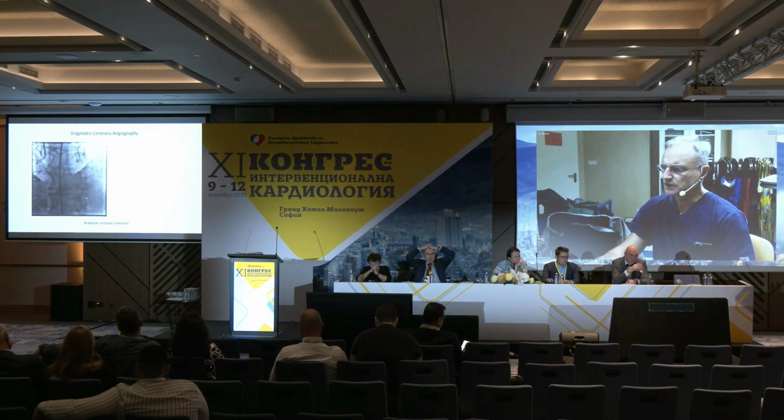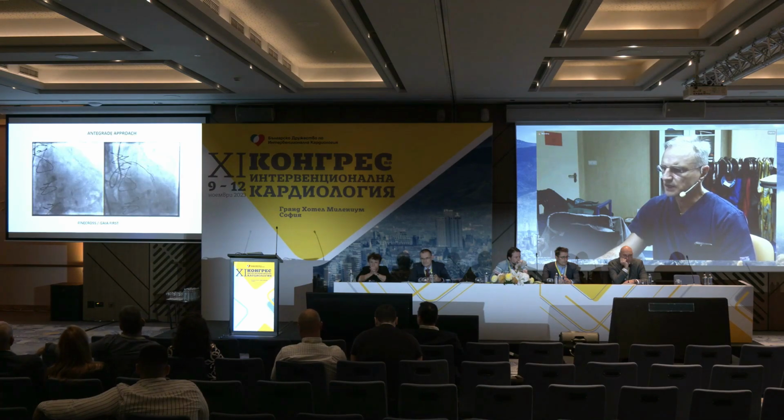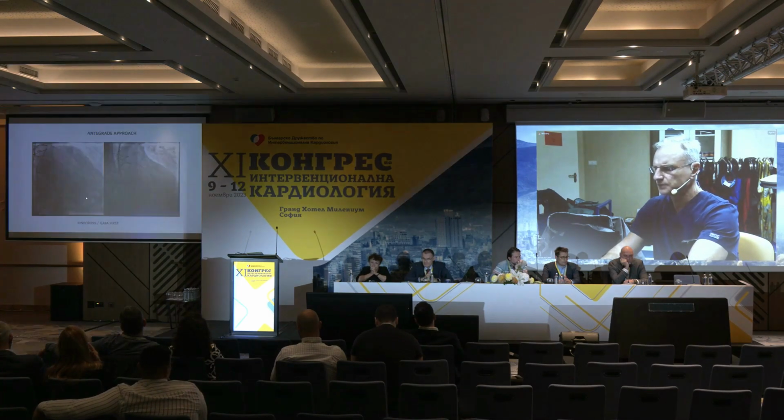dissection reentry techniques. And one modification of this is the use of doing this procedure, especially when you're doing LADs or CTOs close to the left main, as in this case, it was a LIMA failure in a young guy. That was done a few years ago here in Bulgaria. And the antegrade attempt failed for the first time, for the third time.